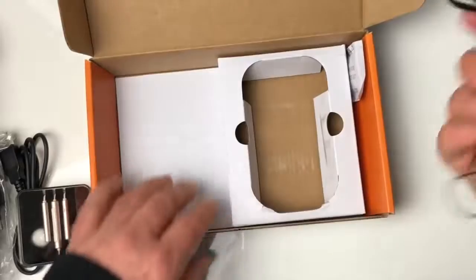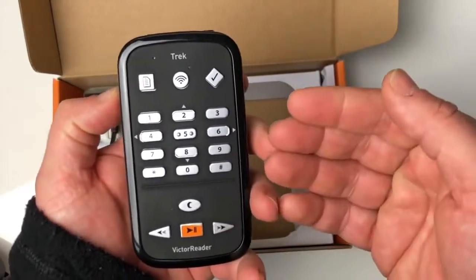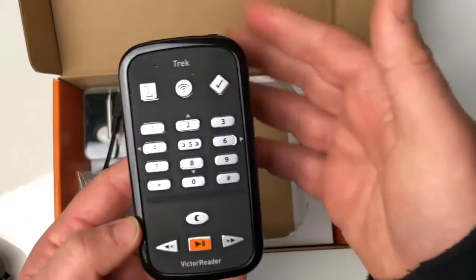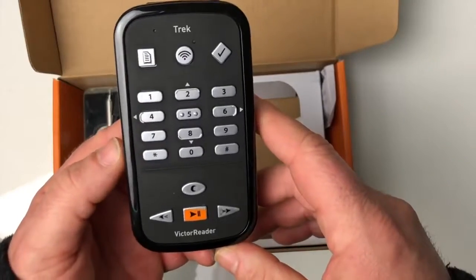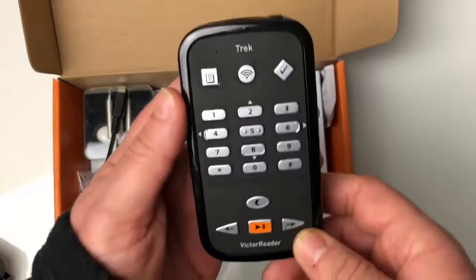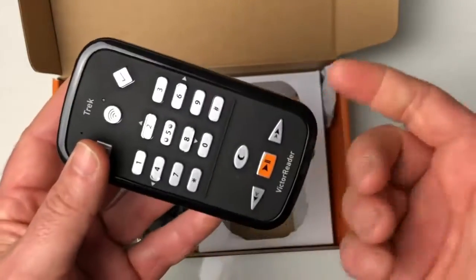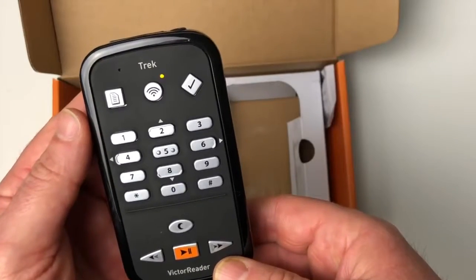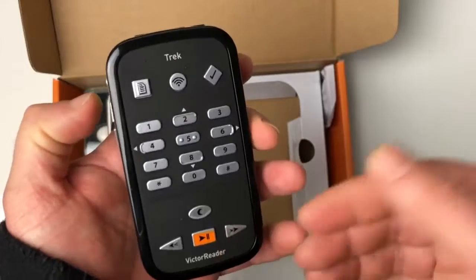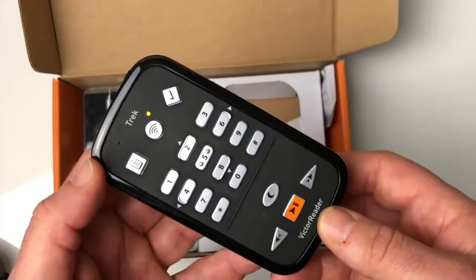Voilà tout ce qu'il y a dans cette boîte. Si on allume l'appareil, au premier allumage on sent une petite vibration qui nous dit que l'appareil est en cours d'allumage. C'est un petit détail bien sympa : étant donné qu'il a vibré, on sait que l'appareil s'allume. On entend ensuite : « Bienvenue à Victor Reader », « Orientation », volume extérieur 5, recherche de satellite en cours, connecté au réseau Wi-Fi.